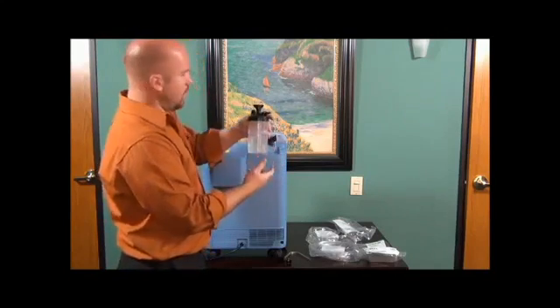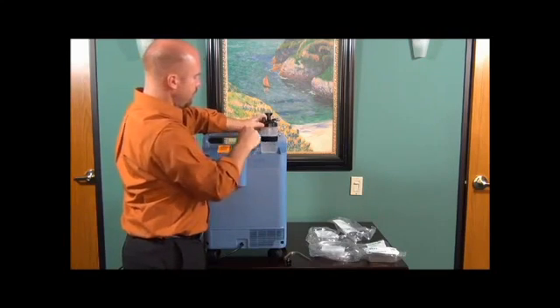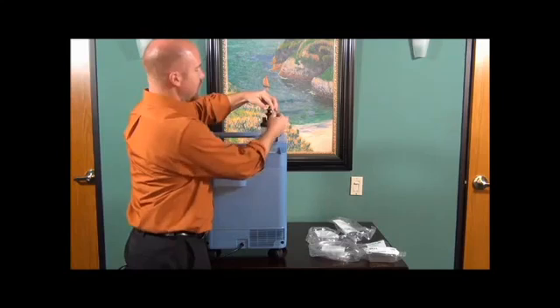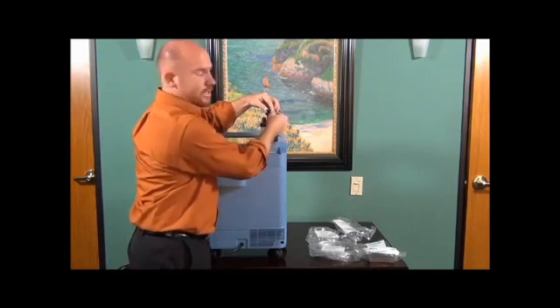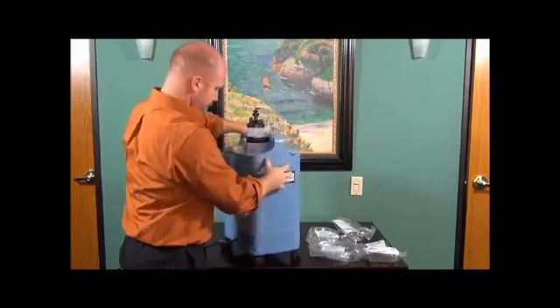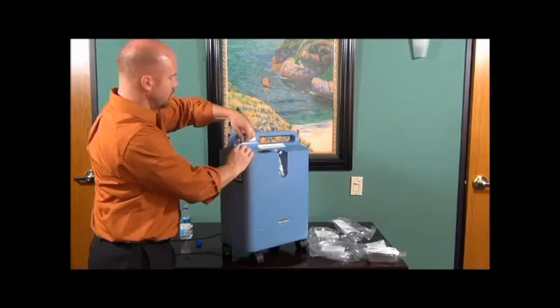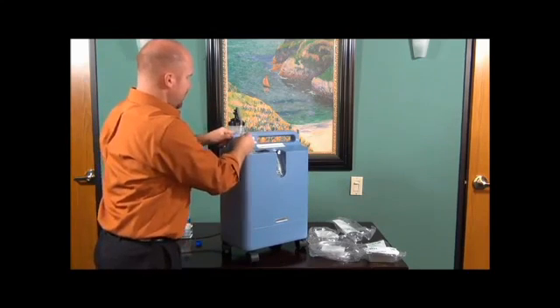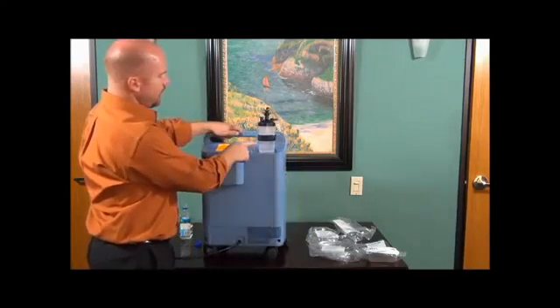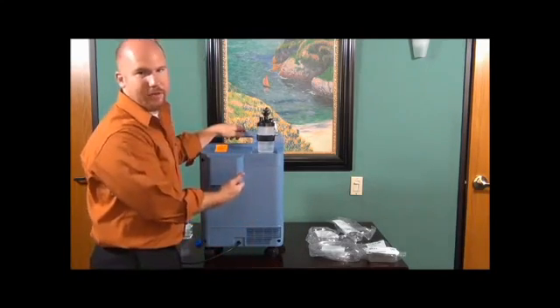So on your Everflow, you'll take this, and this little Velcro area is exactly where you want to put your humidifier bottle. Strap it in tight with the Velcro. You'll take your rubber hose, and that screws on at the top. Same thing, make sure that that's on evenly and straight. You're going to take the other end of the hose. It's going to plug in right here to the port where the oxygen comes out of the machine itself. Put it on nice and snug, then you turn it back on. And then once you see the water bubble, that signifies that you have a proper seal and that you're now going to have humidified oxygen.